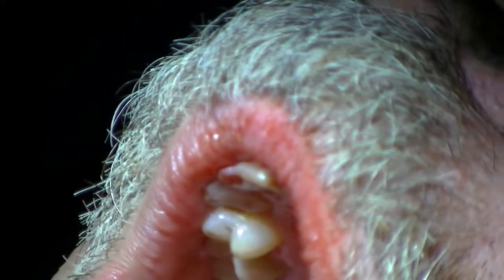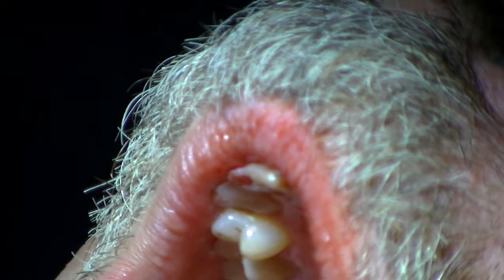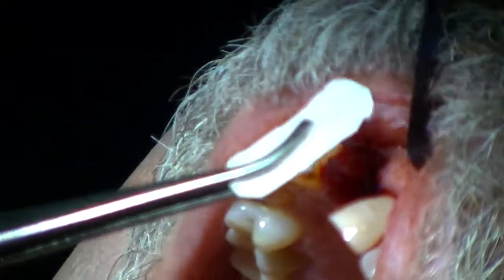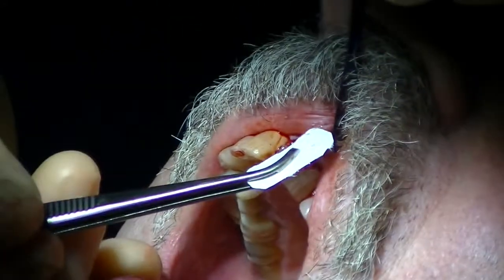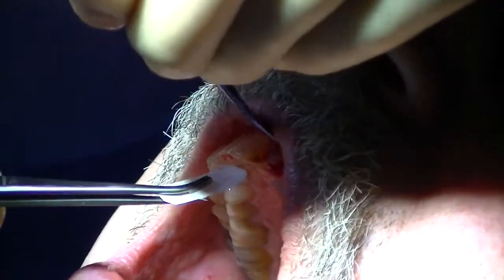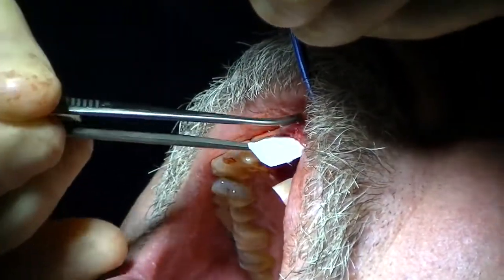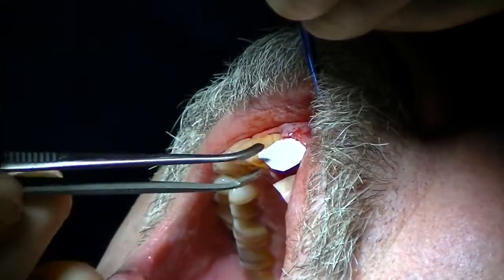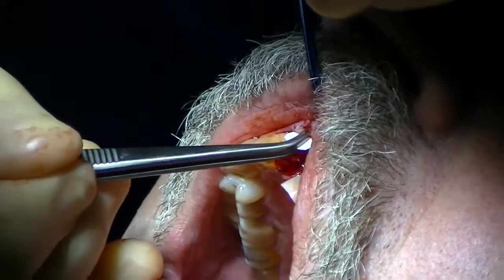Now what I want to leave you with here is, if we had a facial defect, then we could have put this membrane in that area. I pre-cut it, and what we would simply do is slide it down past any defect. I don't have a defect here, but I just want to demonstrate what we're able to accomplish.